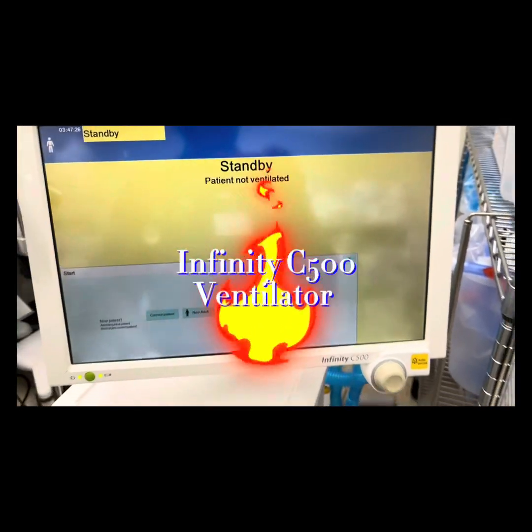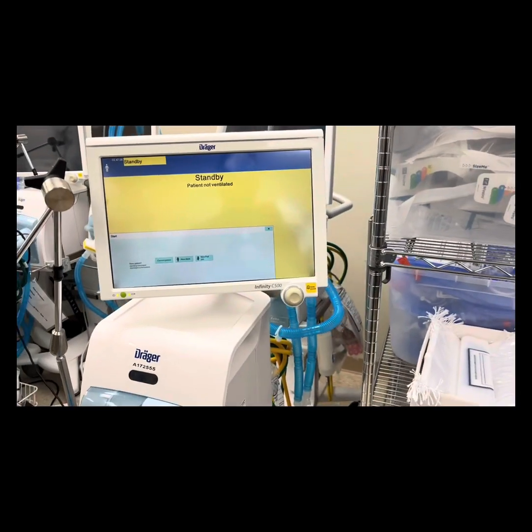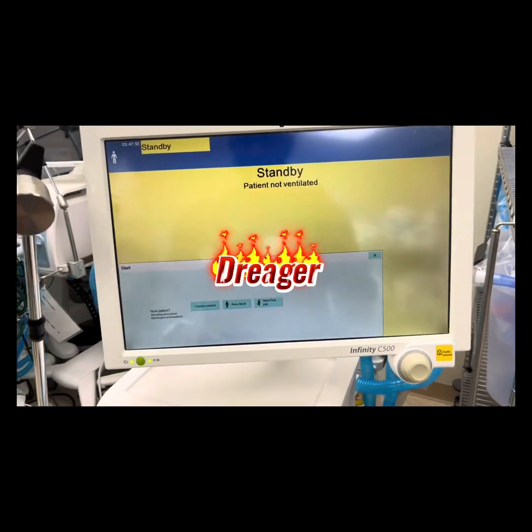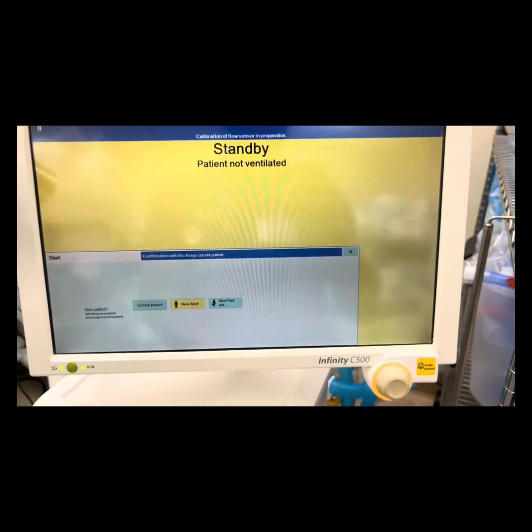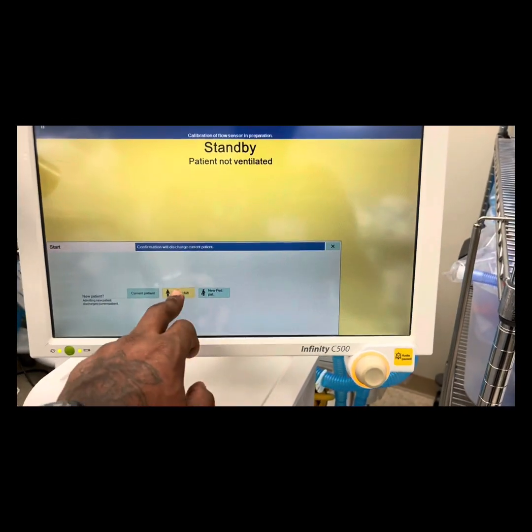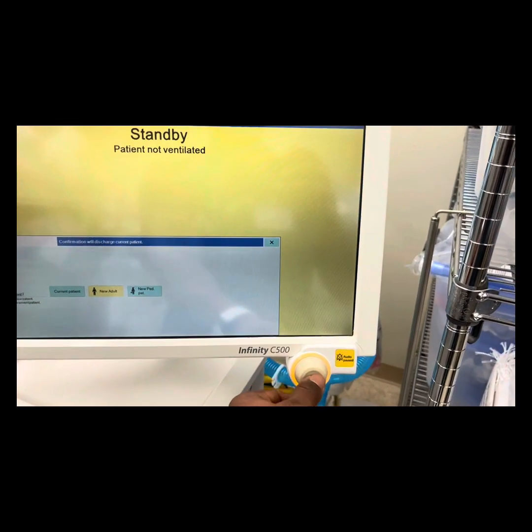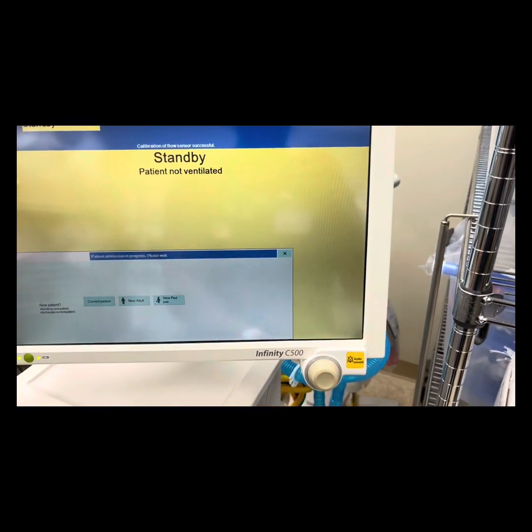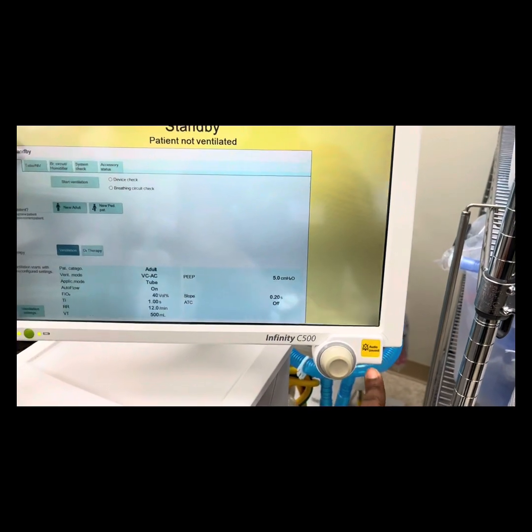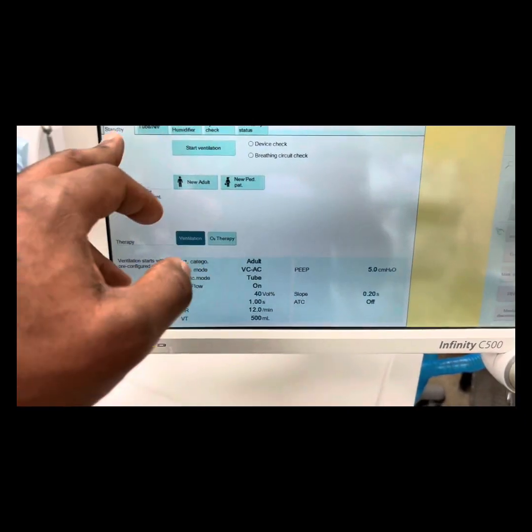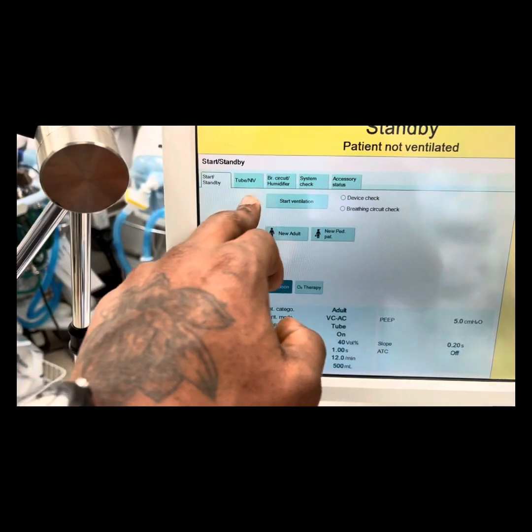Infinity C500 Ventilator — this is our trigger vent. To perform a new patient setup: push, turn, push. Silence, of course. Then standby.